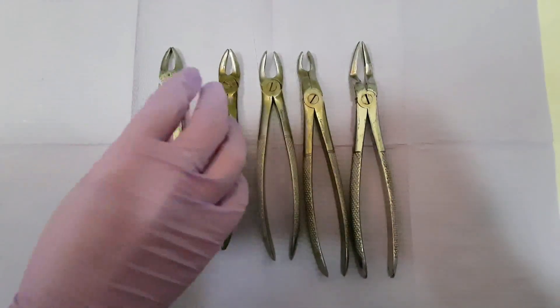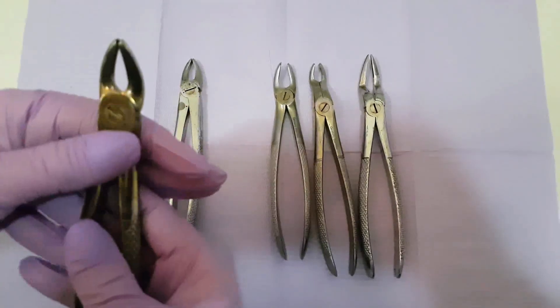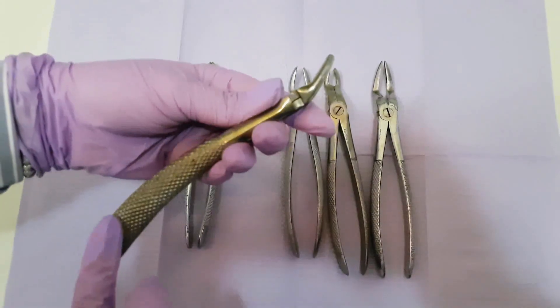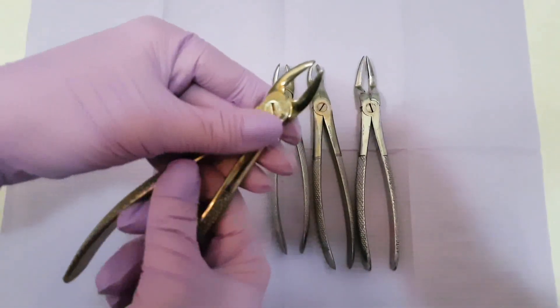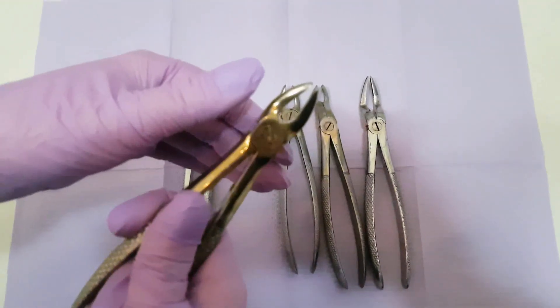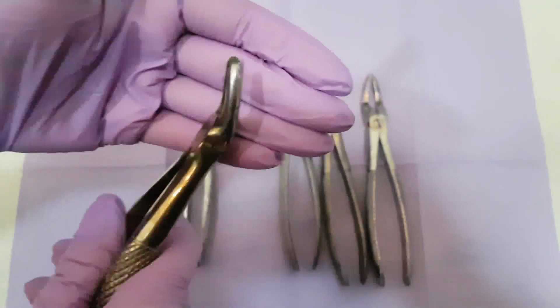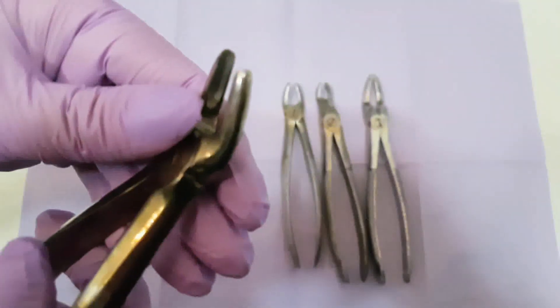Next I want to show you the forcep that is used to extract premolars. You can see the working handles and the hinge that connects them with the working beaks. This forcep is different from the other because the working beaks are put at a certain angle, so we can properly hold the premolars before extracting them.